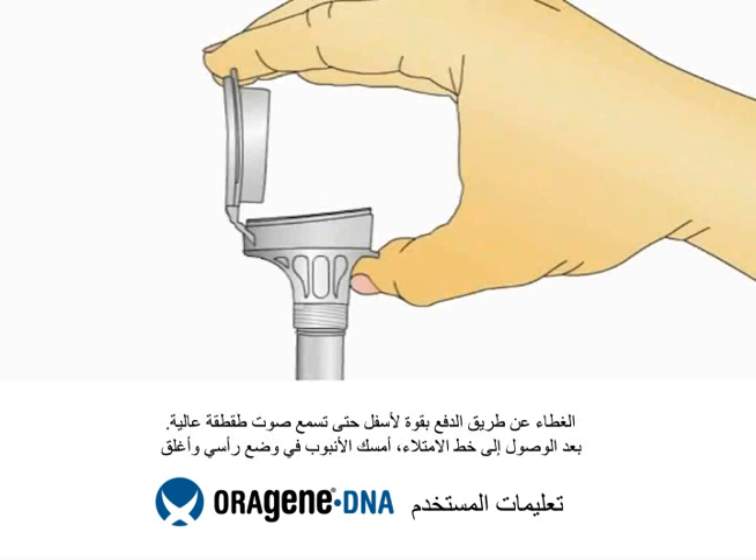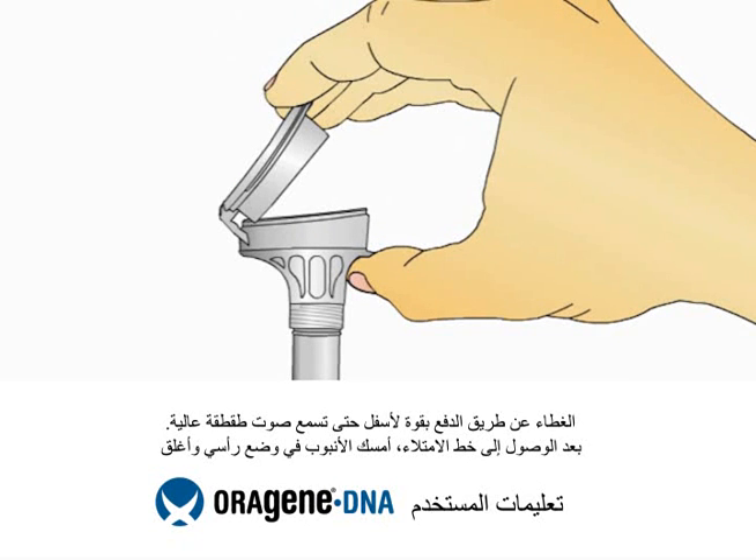Once your saliva reaches the fill line, close the lid by firmly pushing the lid until you hear a loud click.